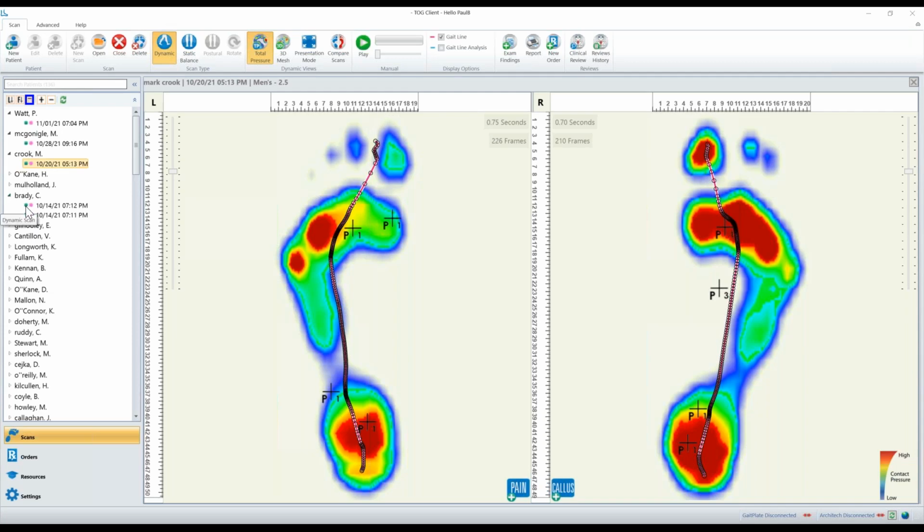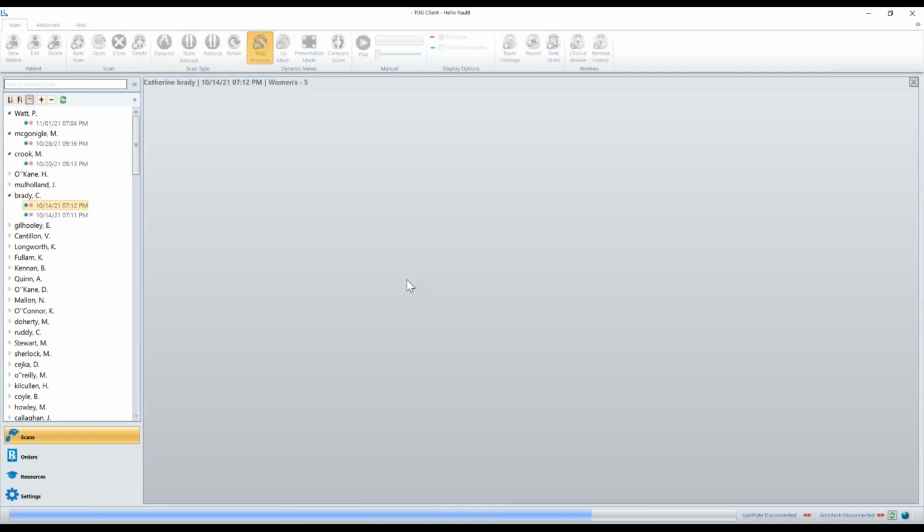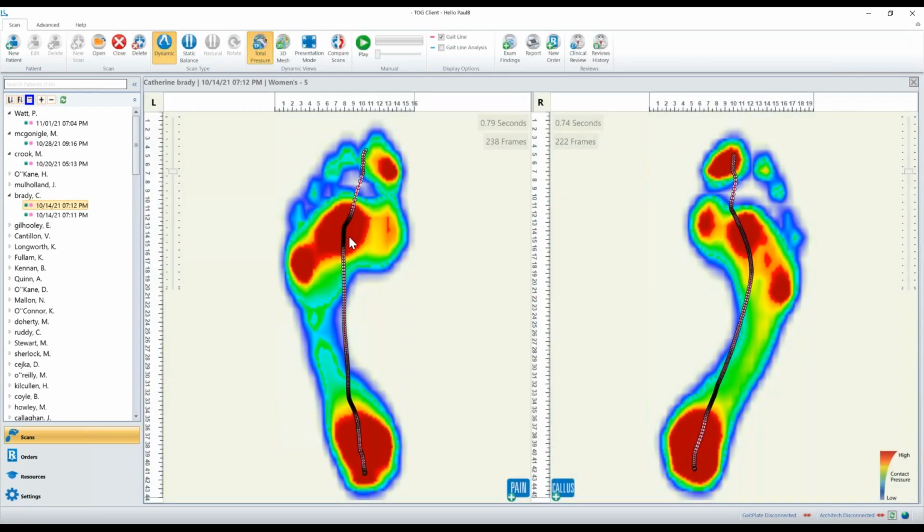We talked about a gait line as well that is straight. So let's ping over to this one. Now we've got a gait line on the left side. I hope everybody can see. This one's fairly straight, and a straight gait line is a very unstable gait line. The best way to think about it is when you take a gait line, it should come up the outside of the foot, roll over, and come back out.